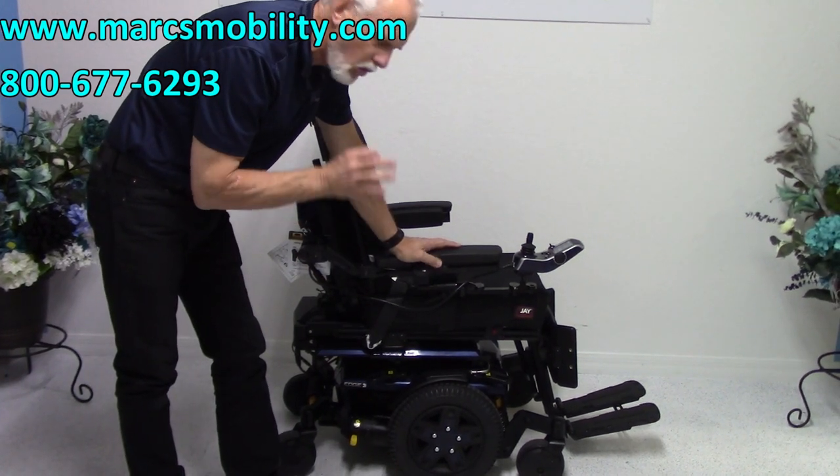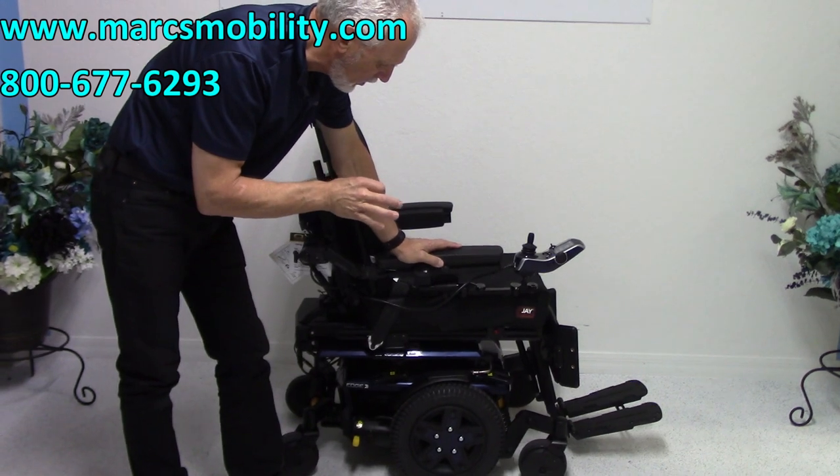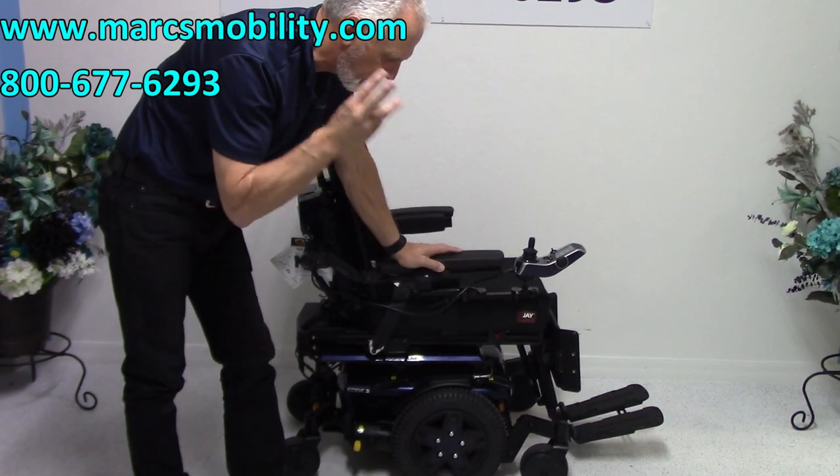This is a Quantum Edge 3. This is the latest one — they just came out with it not too long ago. It's the last version of the Quantum Edge 3.